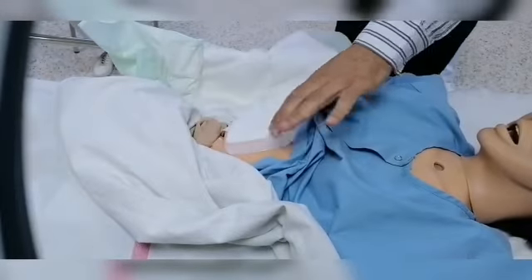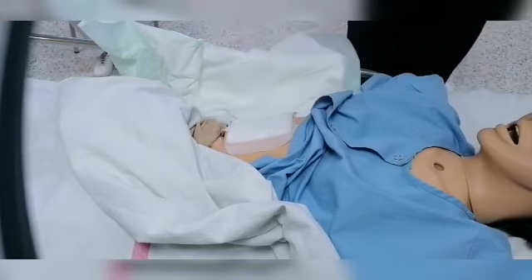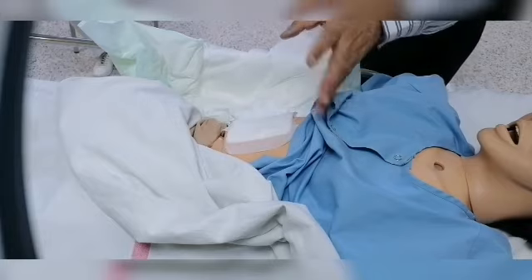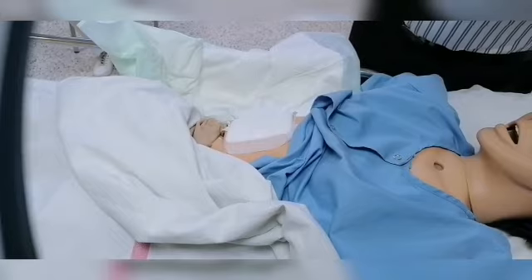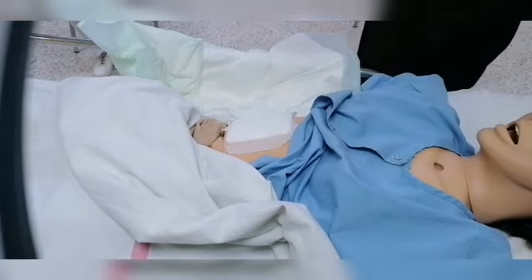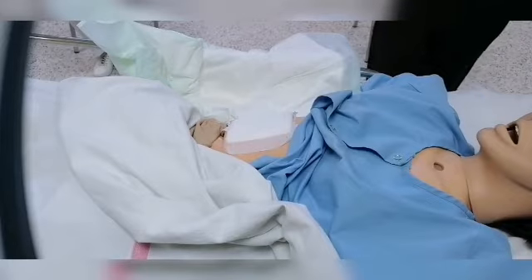When I expose, I expose just the side that I want to work on. This is to avoid embarrassment of the client, and embarrassment for yourself. Then I wear disposable gloves in order to take the previous dressing out.